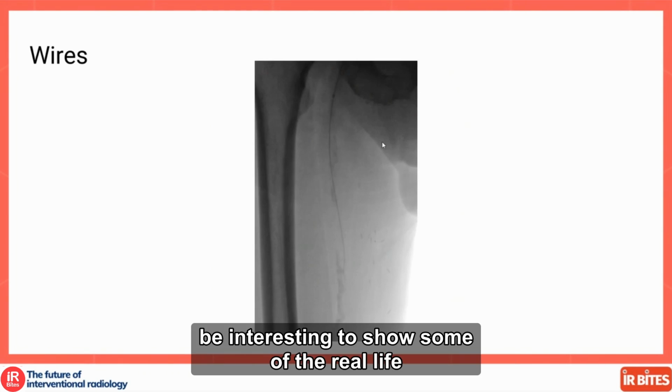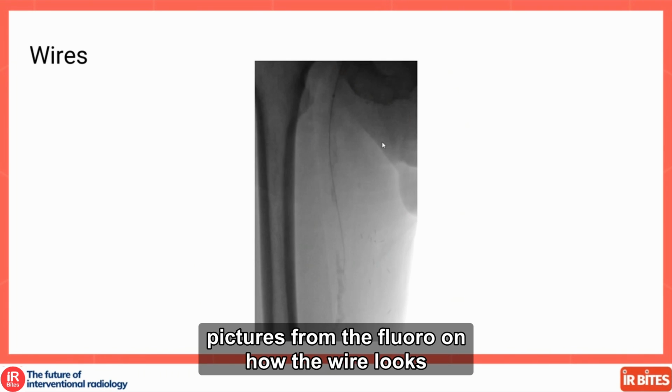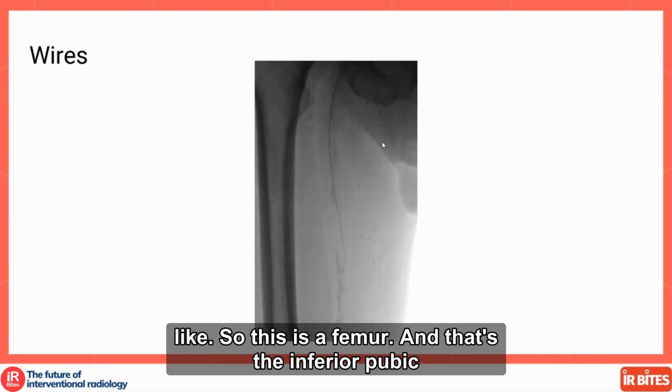So I thought it'd be interesting to show some real life pictures from the fluoro of how the wire looks.